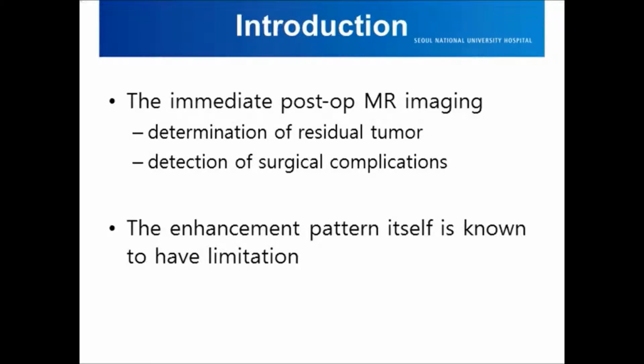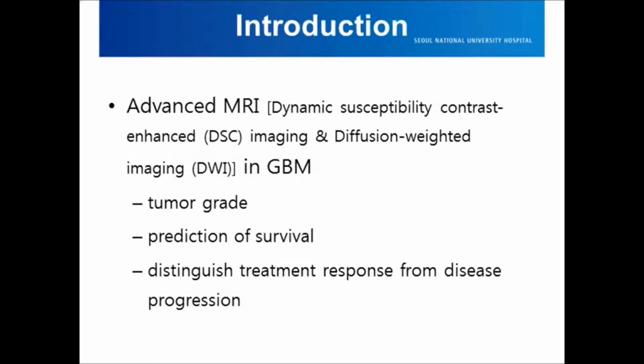However, the enhancement pattern itself is known to have limitations in differentiating residual tumors from enhancement caused by post-operative changes. Thus, these contrast enhancements are commonly recommended to be evaluated by advanced MR imaging. Advanced MR imaging, including dynamic susceptibility contrast-enhanced MRI and diffusion-weighted imaging, have been studied for GBM in many previous studies.